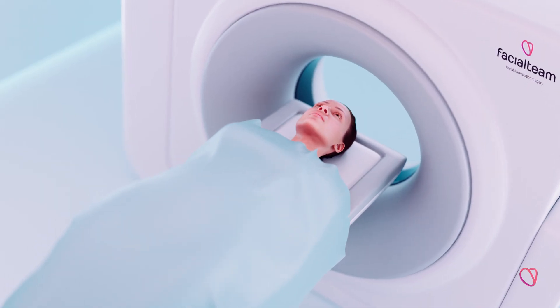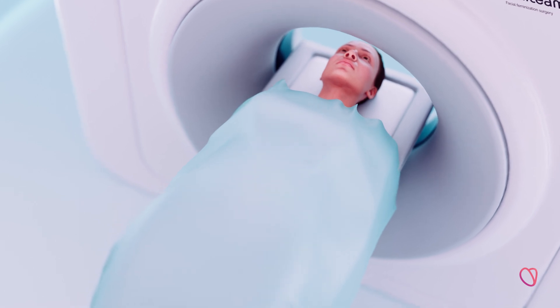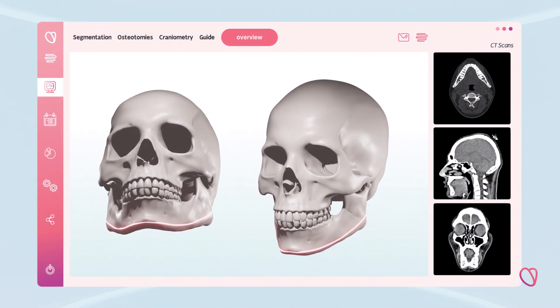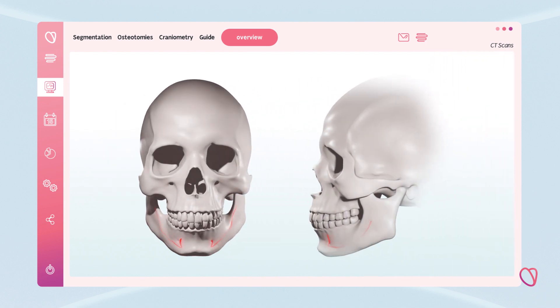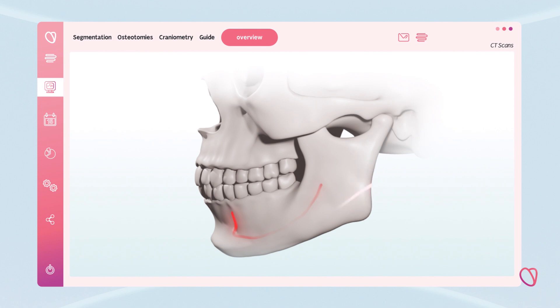The patient has a 3D CT scan that produces a detailed image of the facial structure. The image is uploaded into a software in which the surgeon designs the area to be recontoured. The software then identifies the jaw nerve's trajectory to assure the bone cuts are safe.